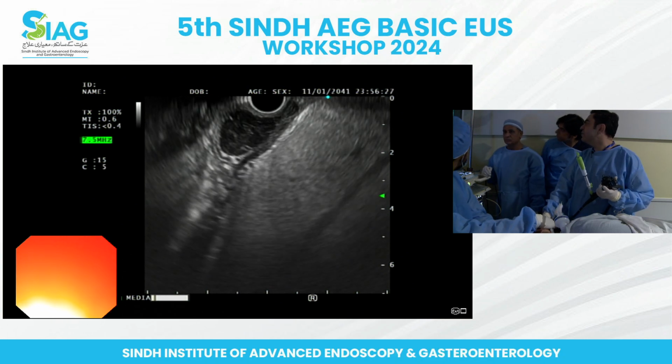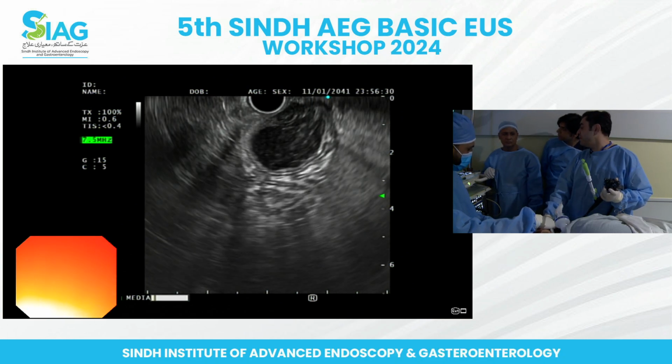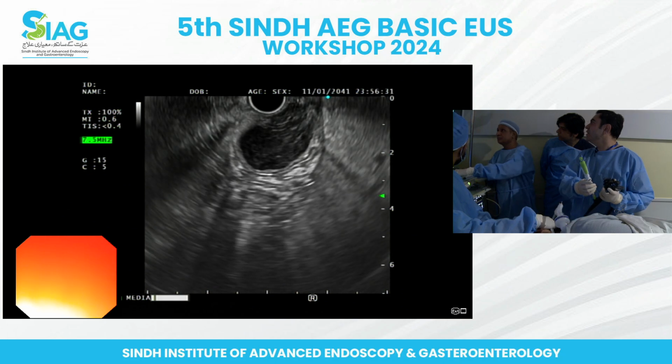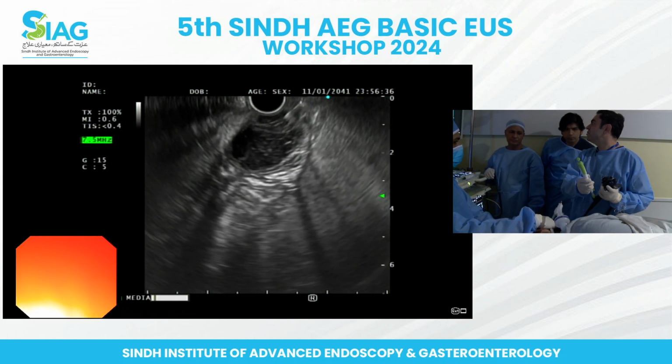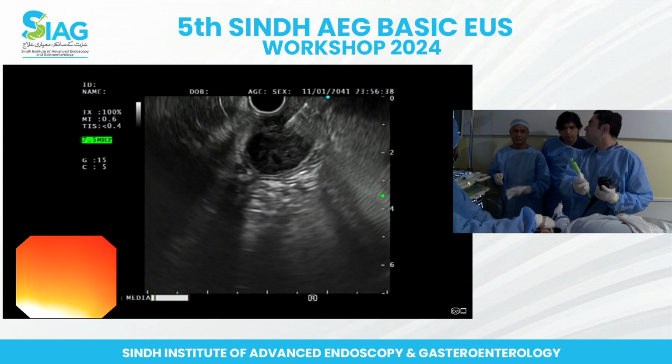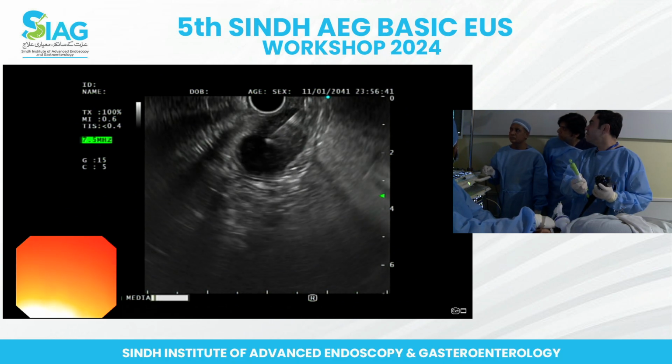So once you've done all of that, I'll just put the last bit of Doppler in. Just before you put the needle in, it's better to put the Doppler. Yeah, okay, needle back. And then you've got a good view. So I'll just jab it in. So we are in, okay.